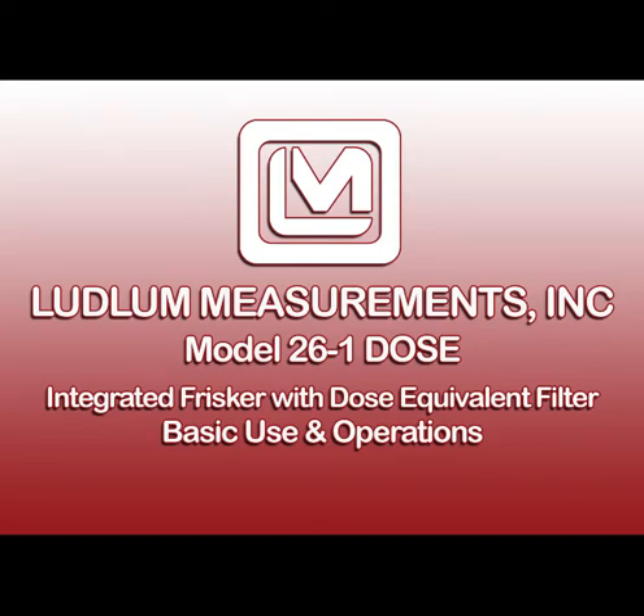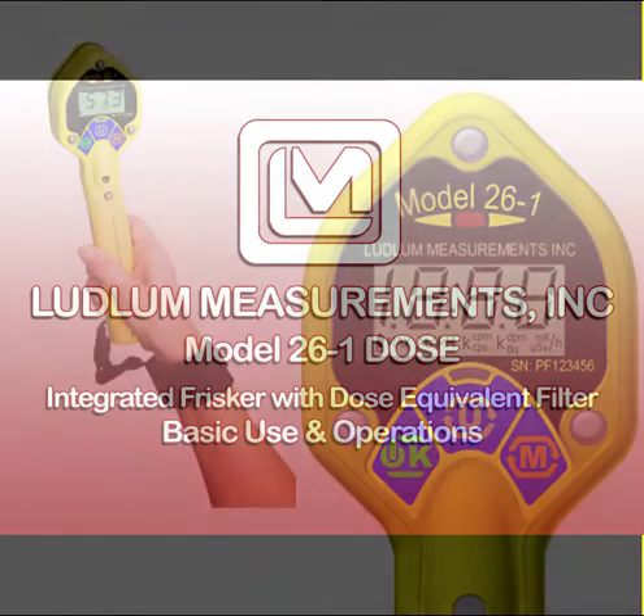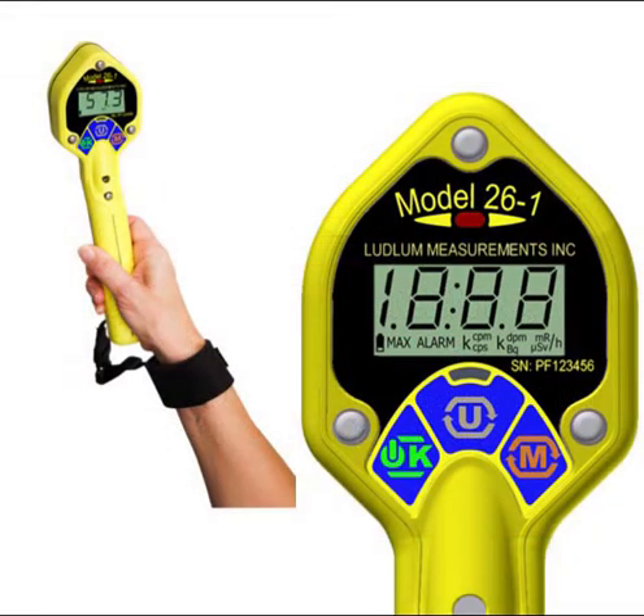This video covers the basic use of the Model 26-1 Frisker. The Model 26-1 is an ergonomic, lightweight instrument which can be used for alpha or beta contamination monitoring, or for measuring gamma exposure or dose rate. It utilizes a standard pancake Geiger-Mueller (GM) detector that is capable of detecting alpha, beta, or gamma radiation.